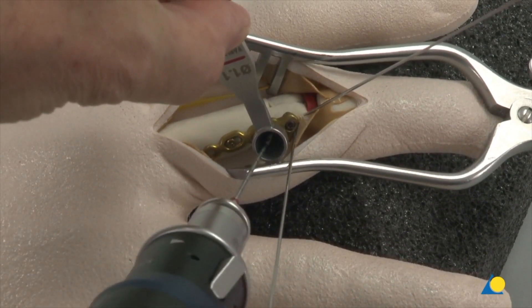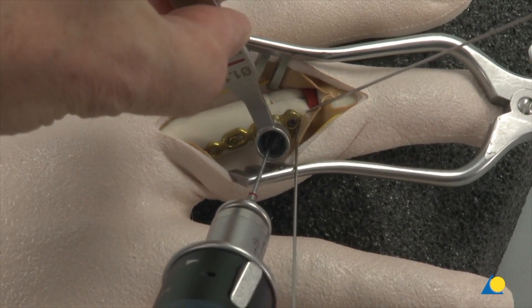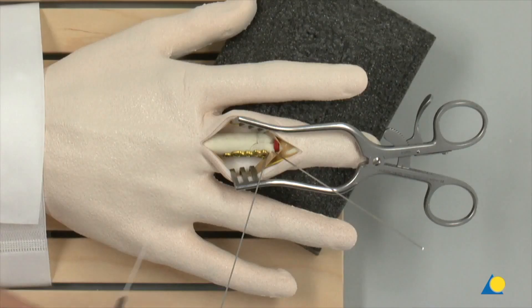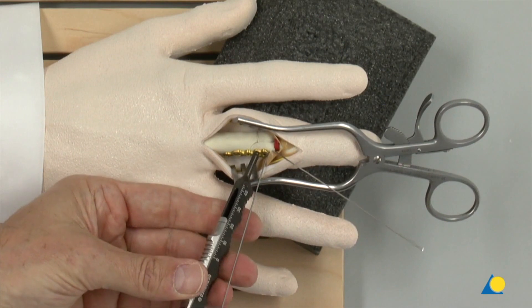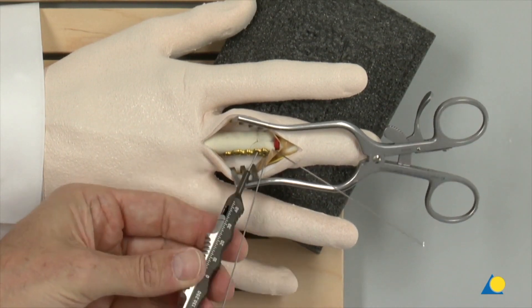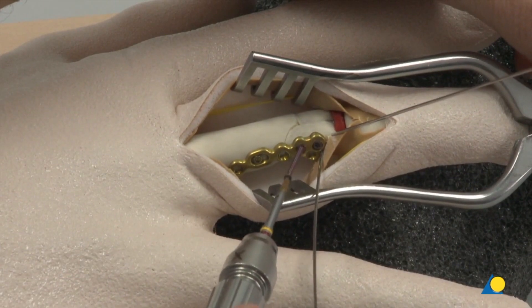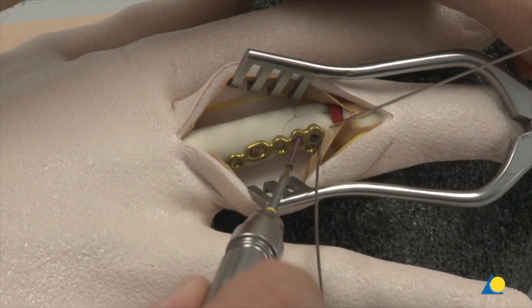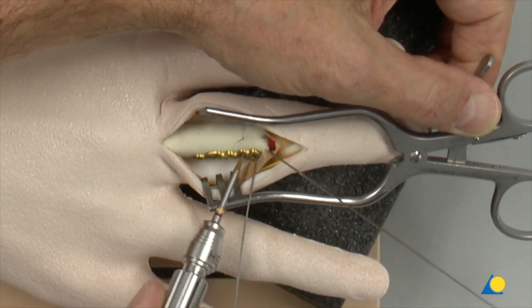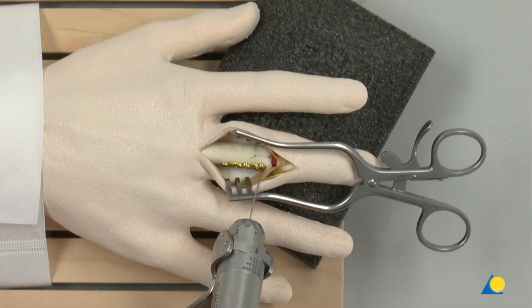The two variable angle locking screws are inserted through the plate head holes into the fracture fragments using the 1.1 variable angle double drill guide and 1.1 mm drill bit. The two locking screws are used to secure the fragments and the K-wires are removed.